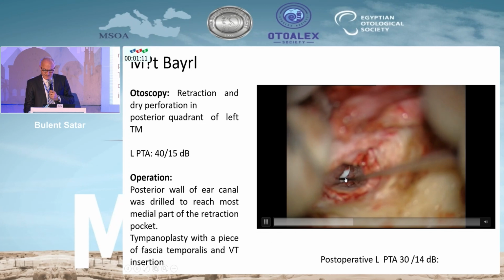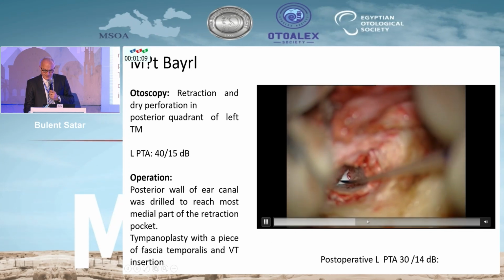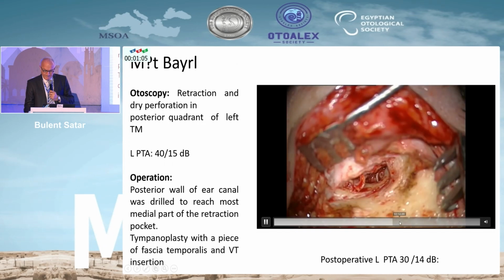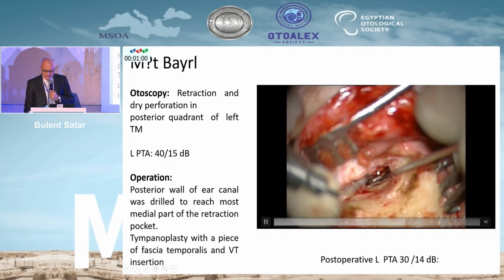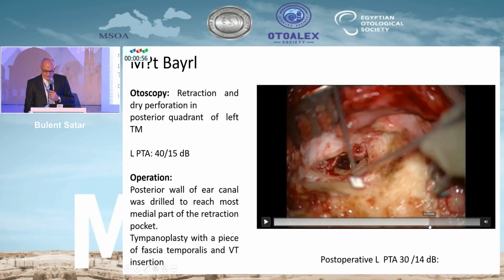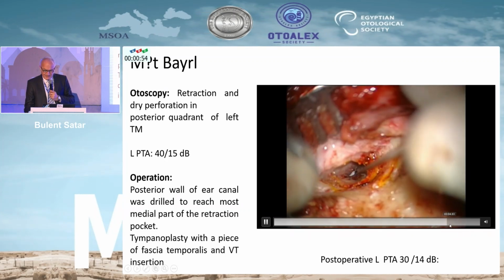I first placed the ventilation tube, and then I placed the piece of fascia and supported it with gelfoam.